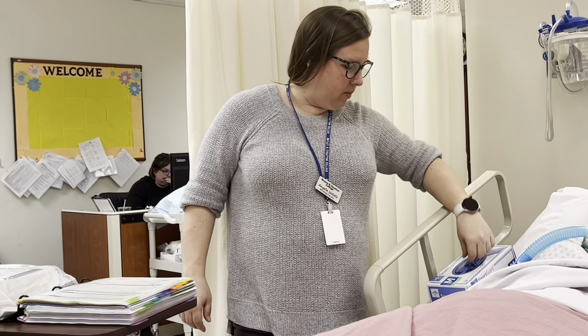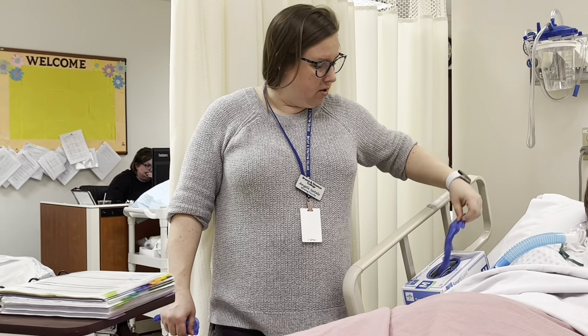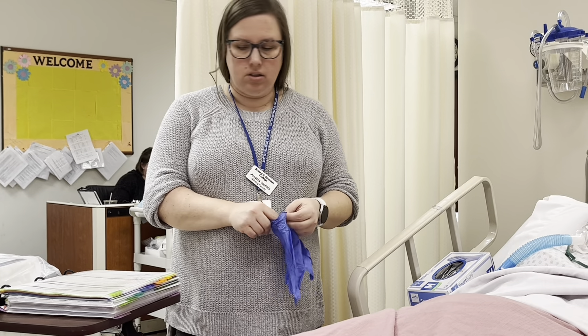I'm going to knock. Hello, my name is Angie. I'm going to be your student nurse today. Can I have your name and date of birth? Judy Smith, 10-2-1963.